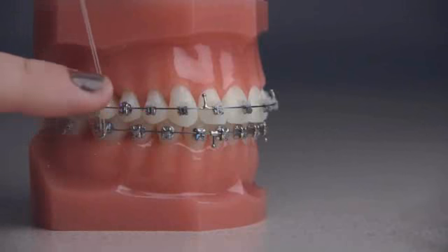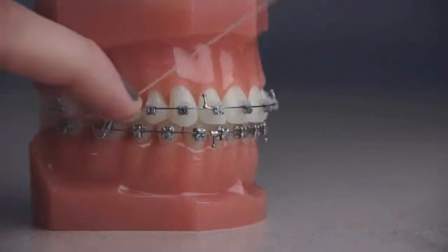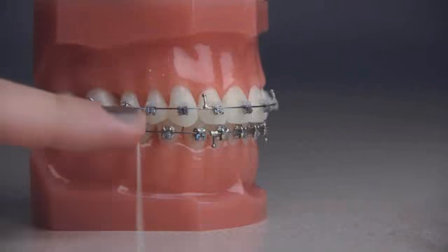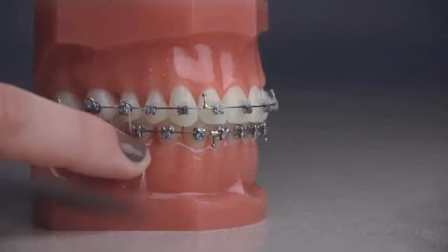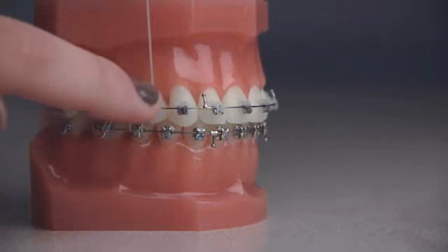Next, wrap it around the first square bracket from the back on top, then the next lower available bracket. Just continue in a zigzag motion, top, bottom, top, and so on. Continue to hold that rubber band tightly.